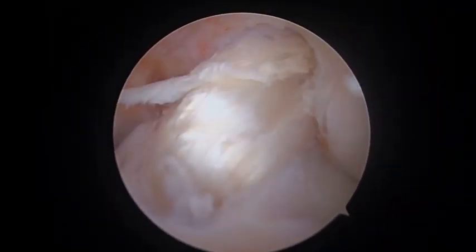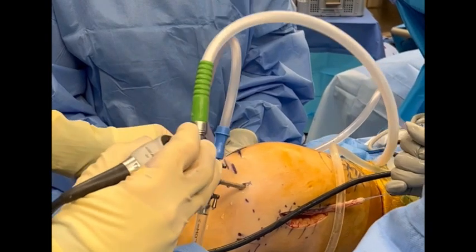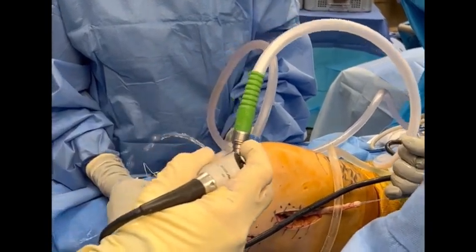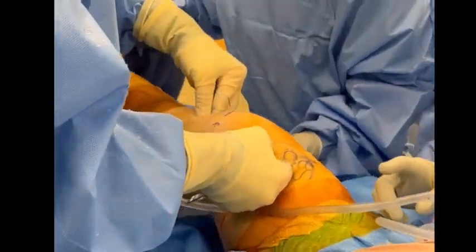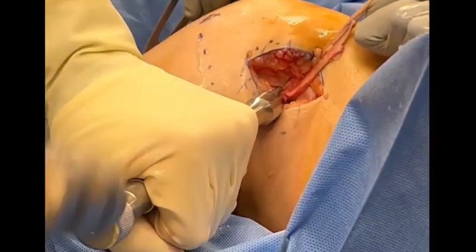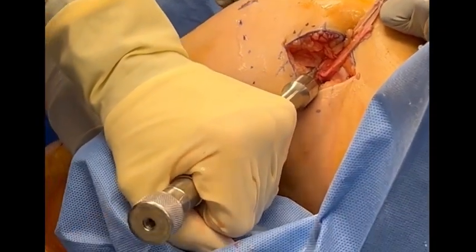The graft is then cycled for an impingement-free, full range of motion 10 times for stress relaxation. The femoral fixation is performed using 2 small staples at the metaphyseal flare to fix the ACL. Tibial fixation is delayed until the remainder of the procedure is completed.